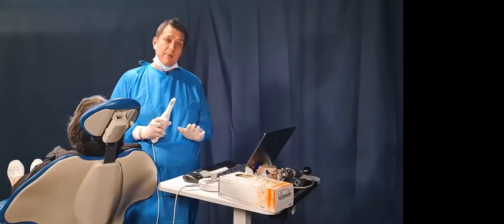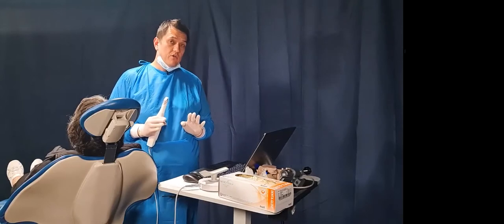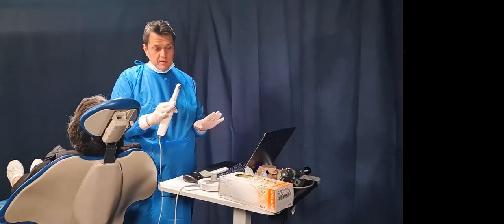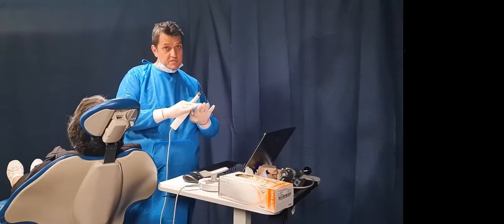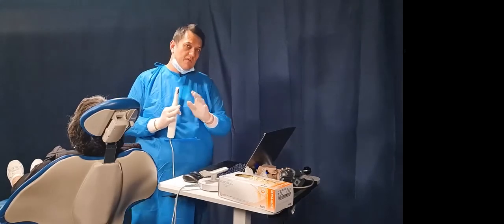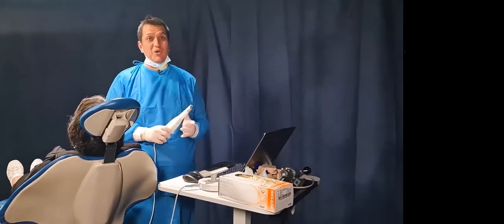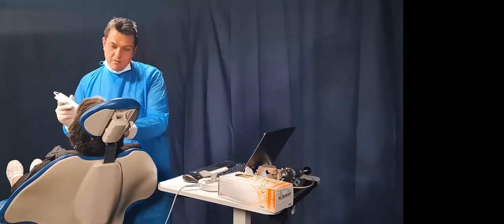spaces of the palate. The palate is the place where you can overstitch because you've come from left to right and then you're starting to fill things in. It is possible to get an overstitching there. So be careful with that and make sure you're very, very strict on your scan quality control. I'll show you how I'm going to fill in those gaps.